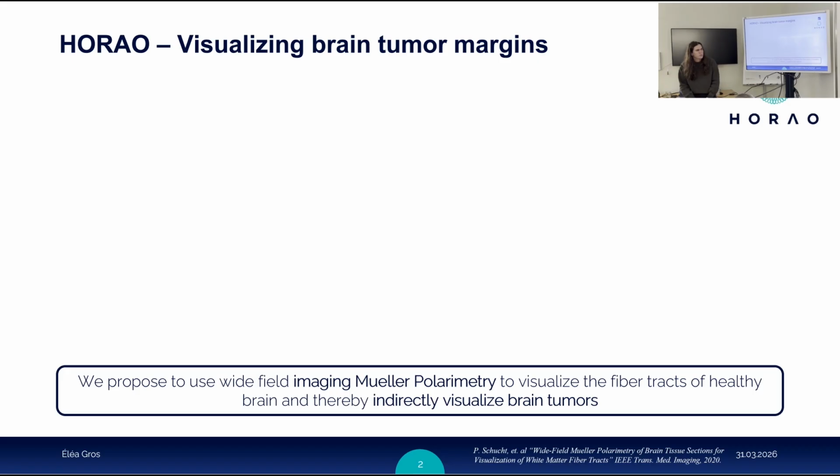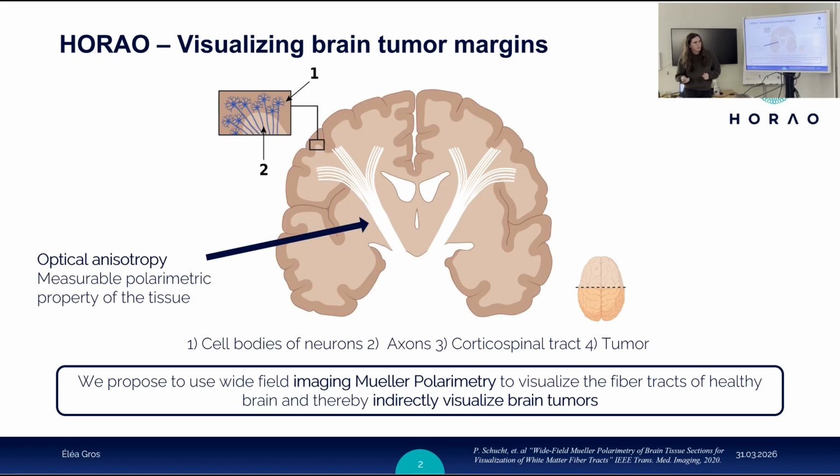There are many problems with seeing the margins of the tumor during surgery, and there are no tools that really allow detecting the borders of the tumor while also visualizing the fiber tracts. We're using Mueller polarimetry to solve this issue.